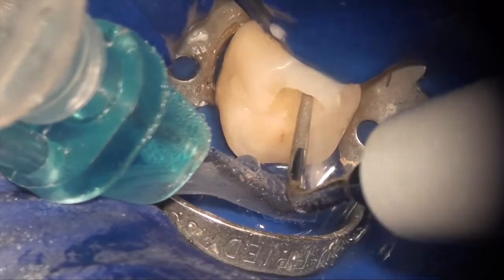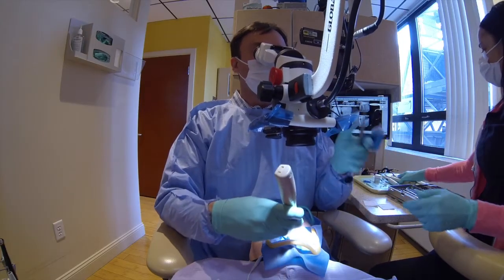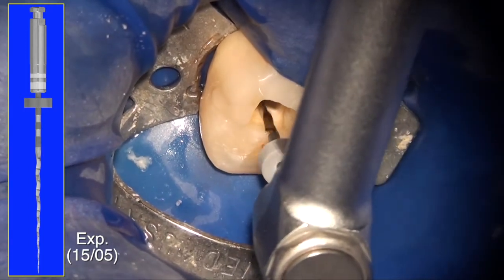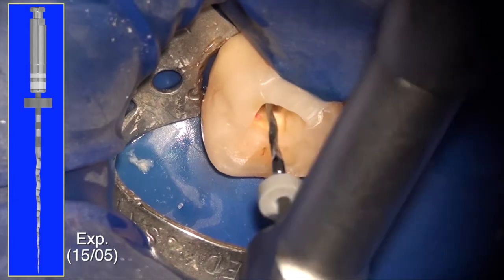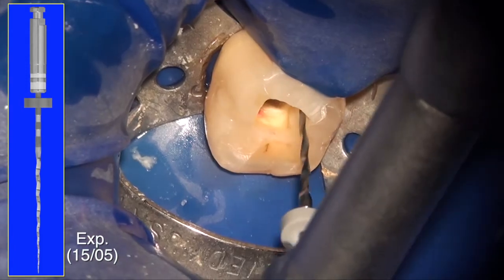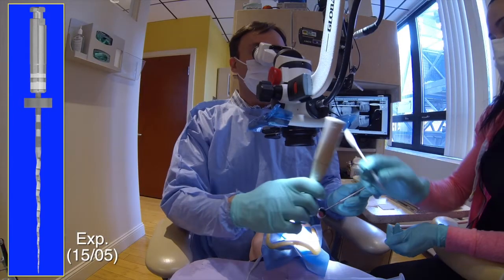So then I'm using, as usual, as I've talked about in the past, and there will be other tutorials on it, the ultrasonic and water to very quickly remove the debris. Now I'm just using a couple of strokes here of the expediter, which is something you can do, again, making note of the available length. I'm trying to stay short of the available length. All I'm doing at this point is just removal of coronal dentin here.